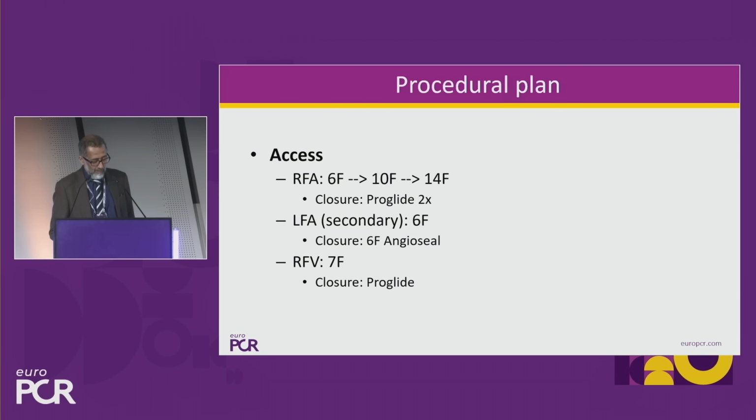I must say, we always put in a femoral venous sheath, under ultrasound guidance, obviously. That, number one, allows me to put a wire into the right atrium as my pacing, so Safari and a wire in the right atrium. I know people do skin pacing. I found it less effective. I don't know what I'm doing wrong, but I find it less effective, so I've always put a wire in. We also, just to say how we do TAVI, have an anaesthetist in the room. The anaesthetist is giving intravenous paracetamol, which is amazing. It's like morphine.